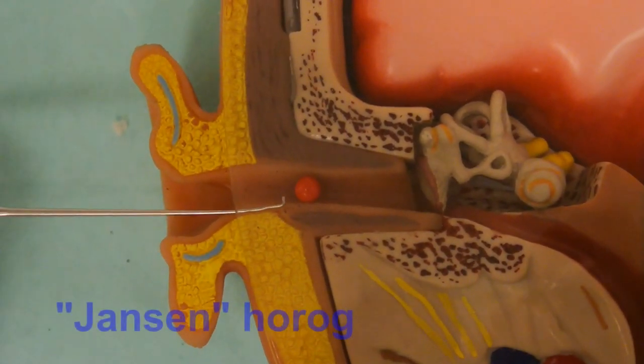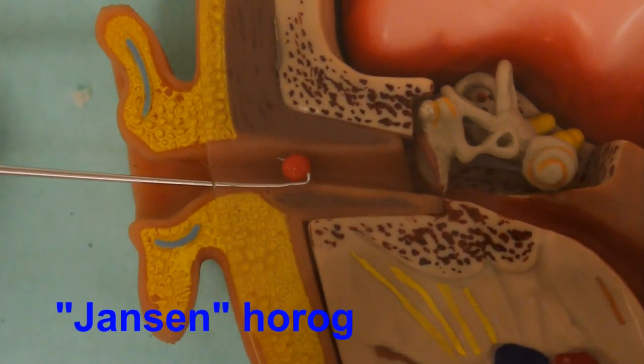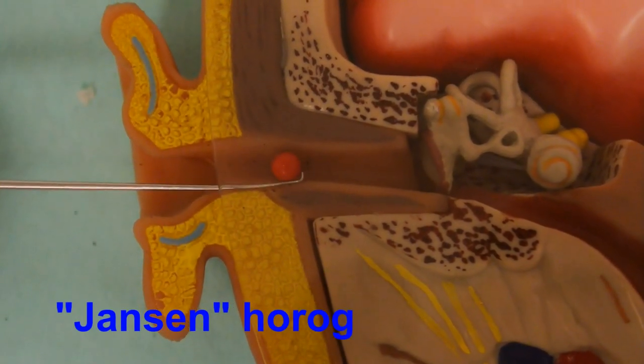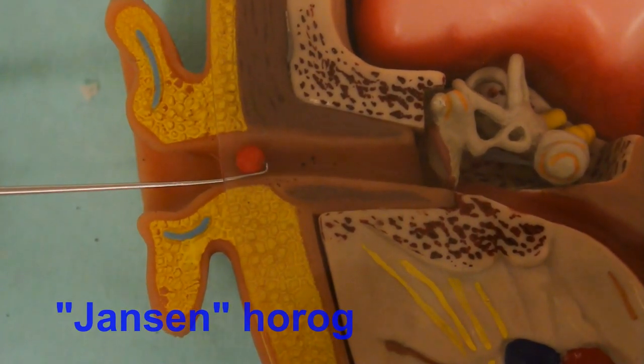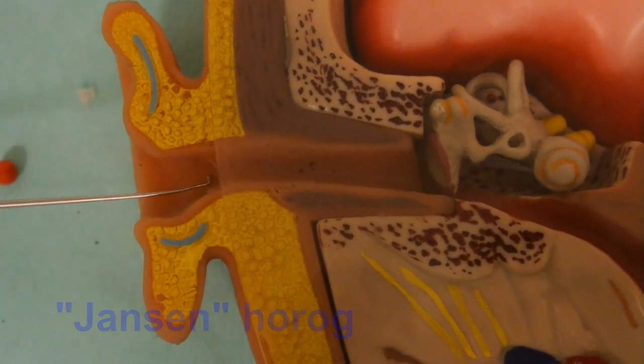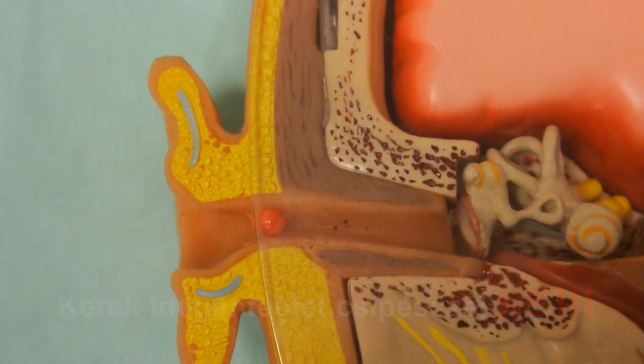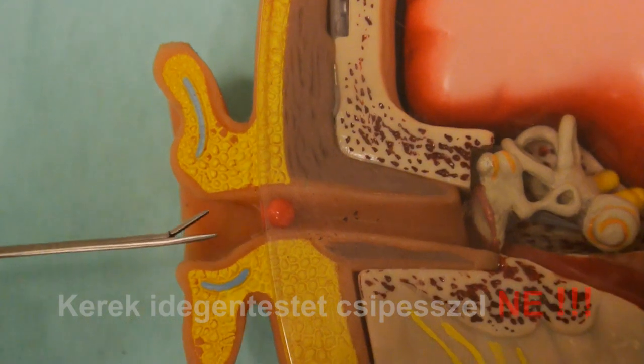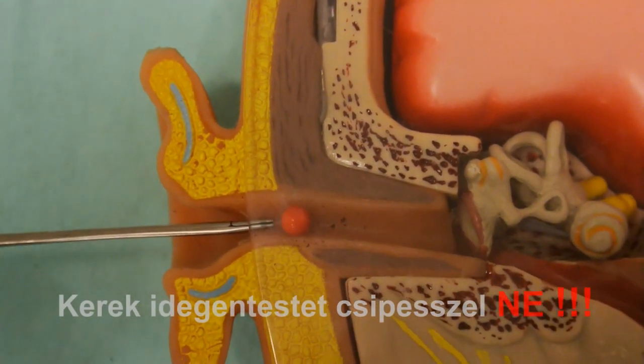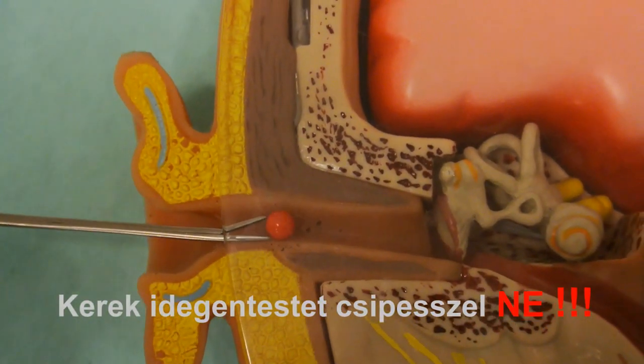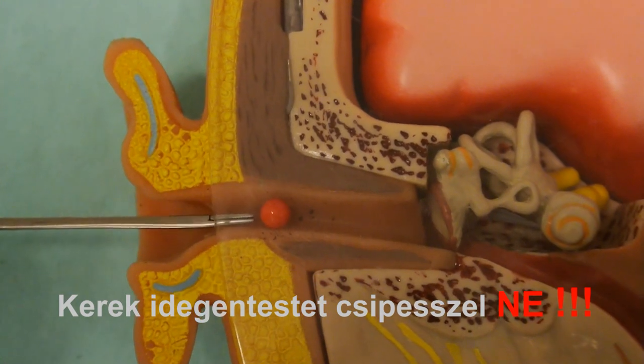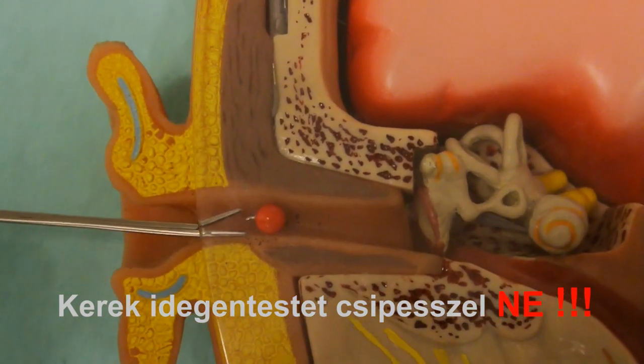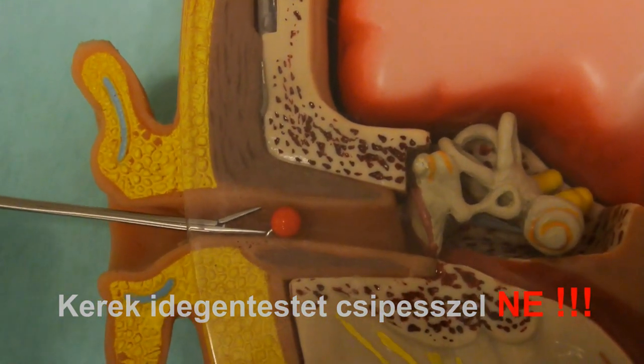It is a tool that has a rectangular tip. With these instruments, we can go behind the foreign body and pull it back out. Do not try to use ear forceps to remove roundish foreign bodies, as this would just further push the foreign body into the ear canal.